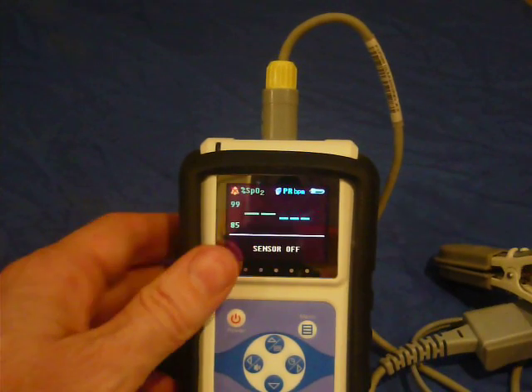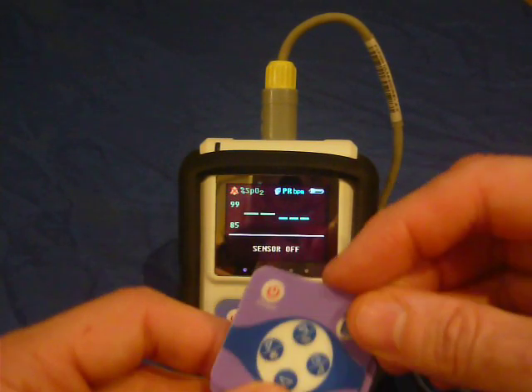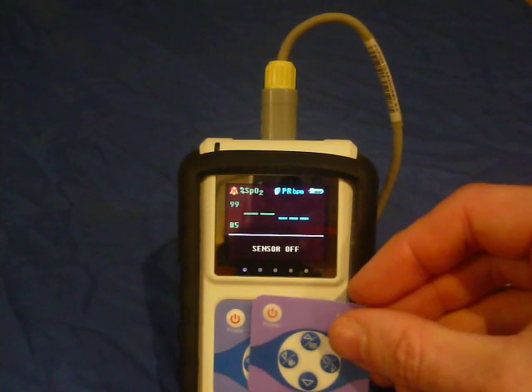Here are some new replacement labels for when labels wear out, which happens after a year of use.